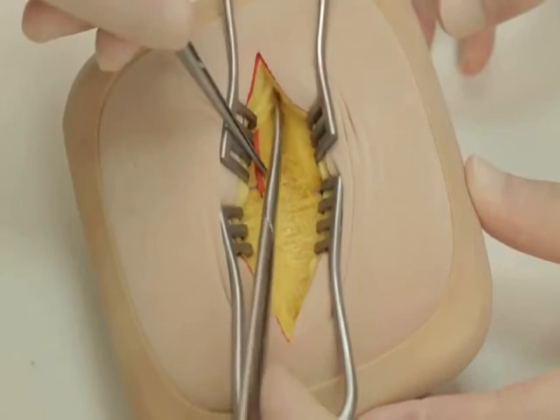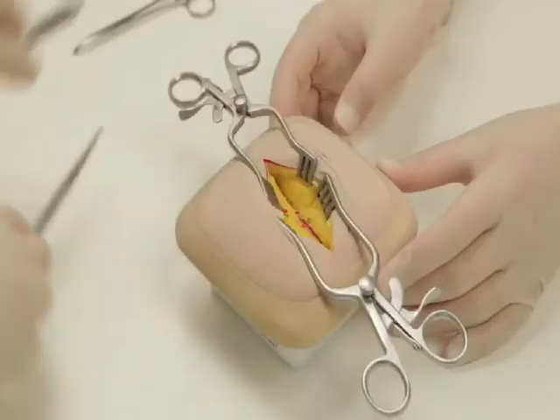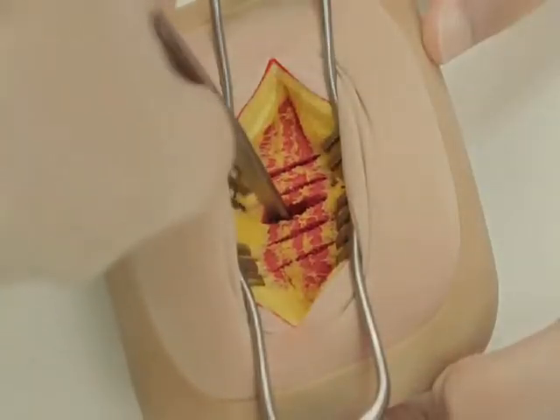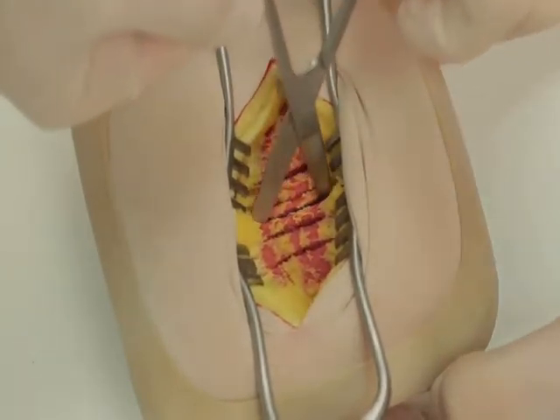Deepen the incision by dividing the connective tissue to expose the fibres of internal oblique. Again, repositioning the self-retaining retractors so you have a confident view. Internal oblique should be split rather than divided by opening Mayo's straight scissors in the line of its fibres.